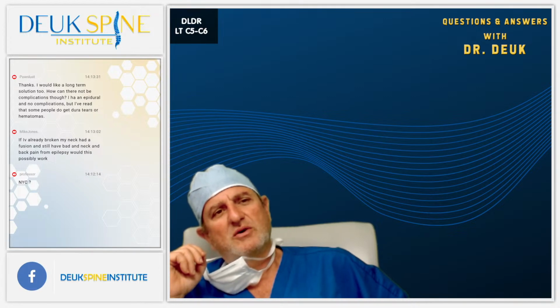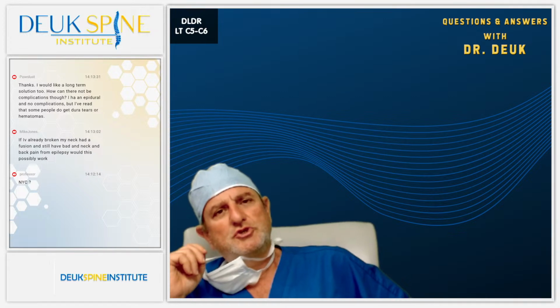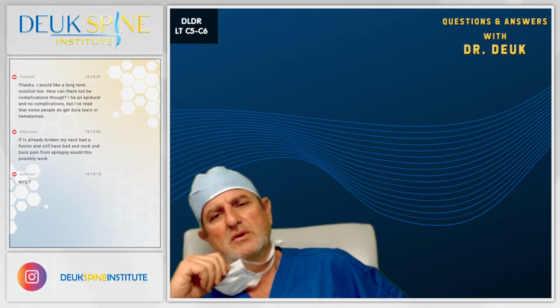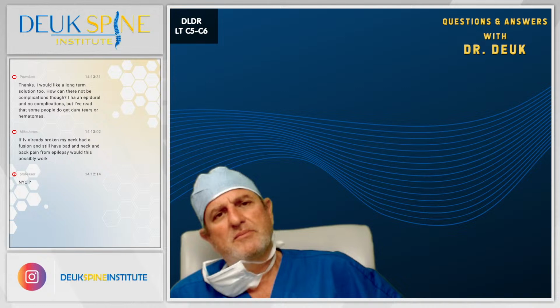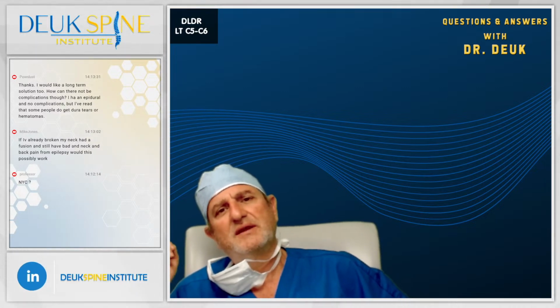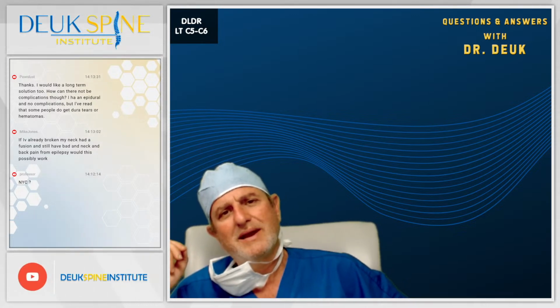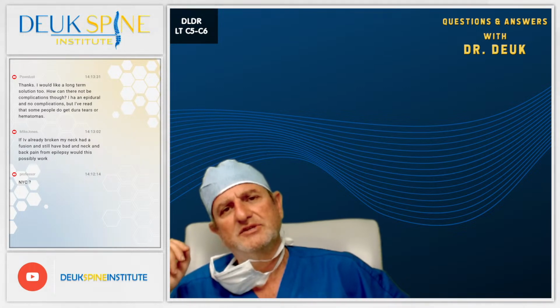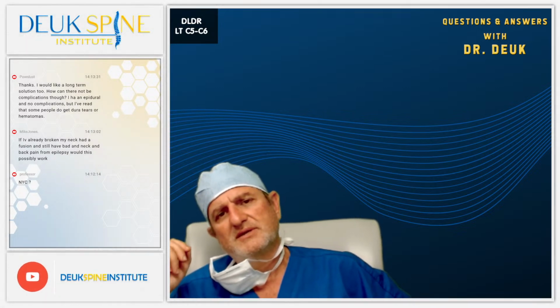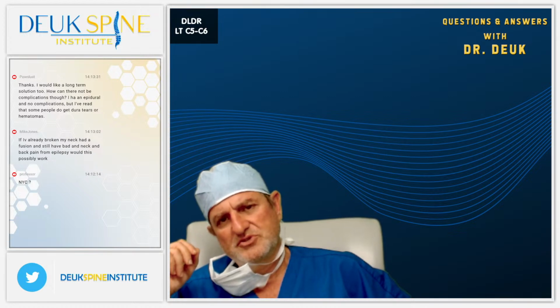Great question. You're asking a great philosophical question. Should you get an MRI to look? The answer is no. You don't need an MRI, because there's one thing more sensitive than an MRI, and that is the endoscope, looking directly at the back of the disc where the herniation is. That's what we do. You can see everything clearly with the endoscope, as you just saw.